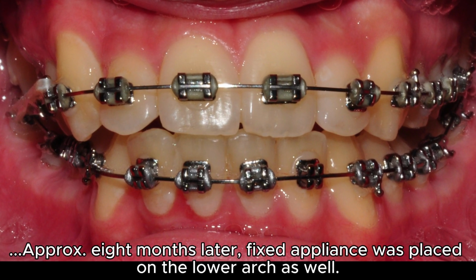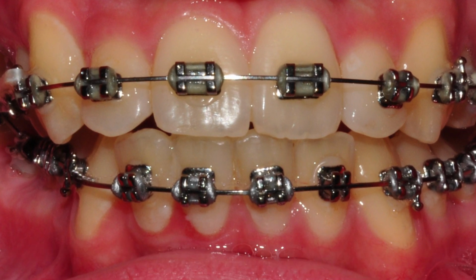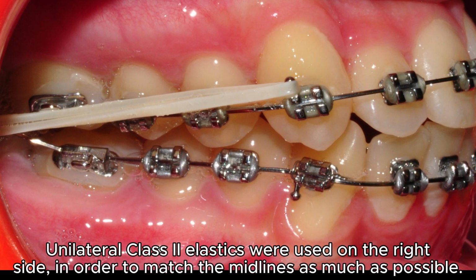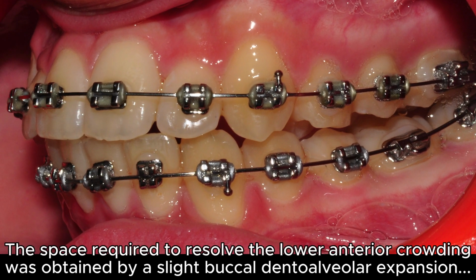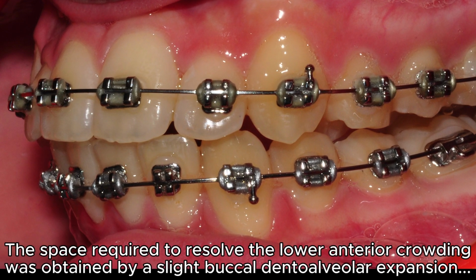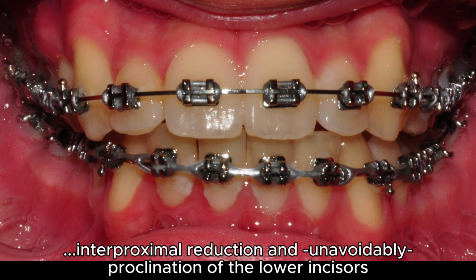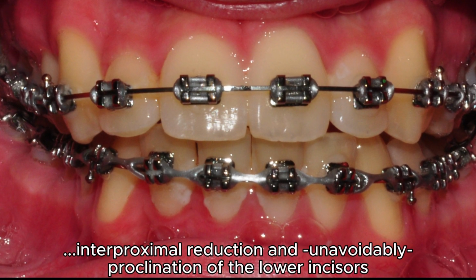Approximately 8 months later, fixed appliance was placed on the lower arch as well. Notice that unilateral class 2 elastics were used on the right side in order to match the midlines as much as possible. The space required to resolve the lower anterior crowding was obtained by a slight buccal dentoalveolar expansion, interproximal reduction, and, unavoidably, proclination of the lower incisors.